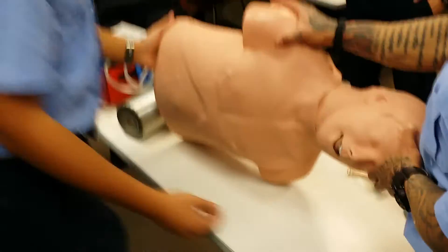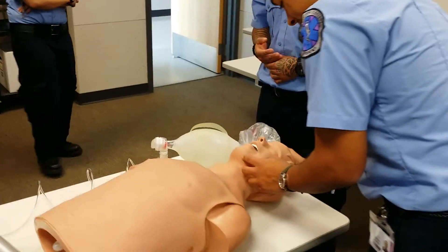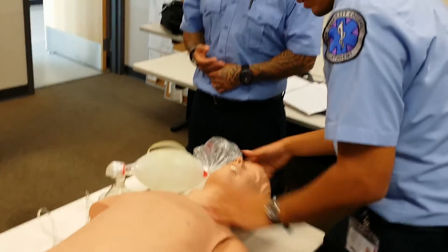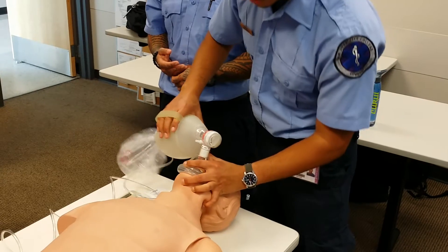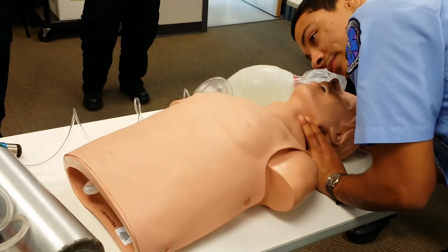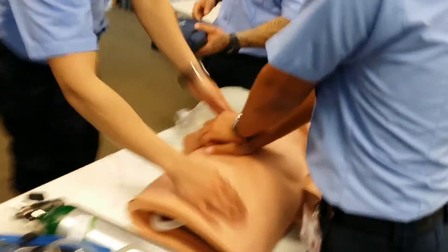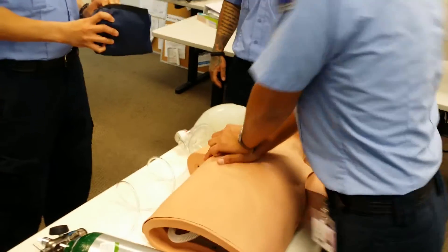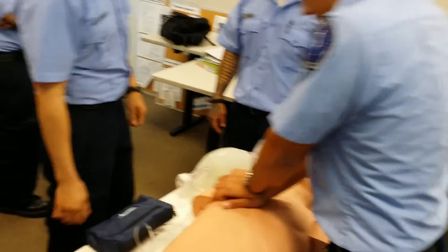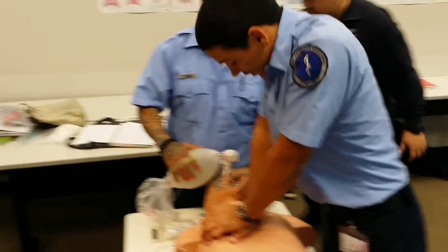Flip back over. I was at rescue breathing — did that for two minutes, now I'm going to reassess the patient. Checking airway, checking his breathing, checking his pulse. No pulse — I'm going to start CPR. I'm going to need an AED — one of my partners is getting the AED. So: 1, 2, 3, 4, 5, 6, 7, 8, 9, 10, 11, 12, 13, 14, 15, 16, 17, 18, 19, 20, 21, 22, 23, 24, 25, 26, 27, 28, 29, 30.